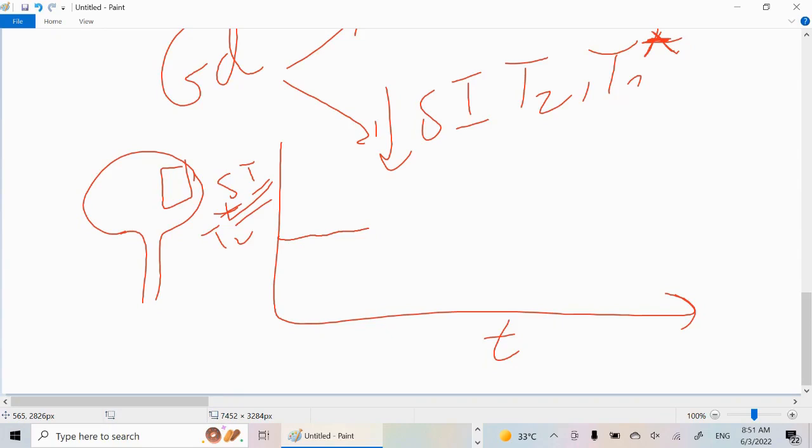What happens when the contrast agent first enters your voxel? There is a loss in signal intensity, and then what happens to the contrast agent? It starts to exit from that voxel and moves along your pathway, which causes your signal to increase and begin to return to your baseline. The amount of loss that occurred is related to the degree of perfusion in the area, compared to the other tissues present. So, the higher the perfusion in that area, the greater the loss.